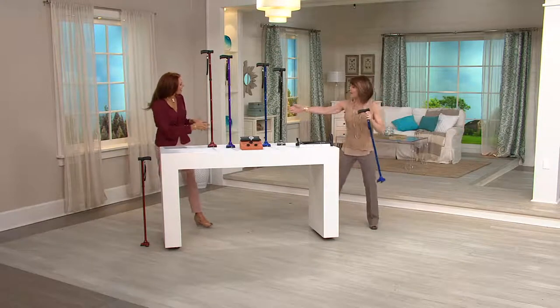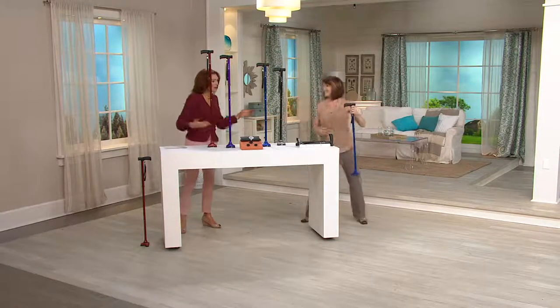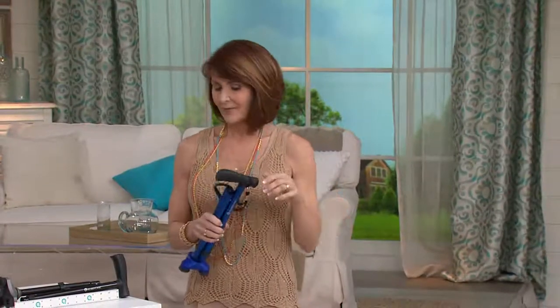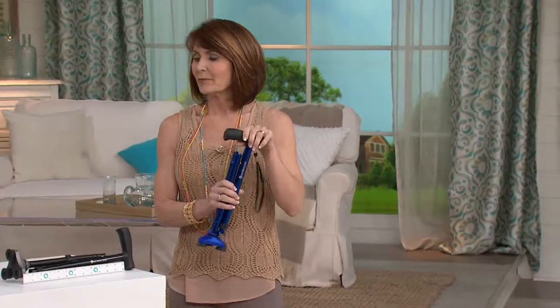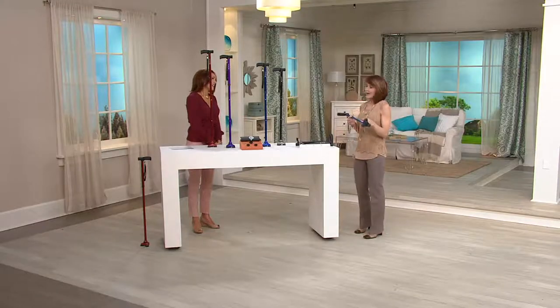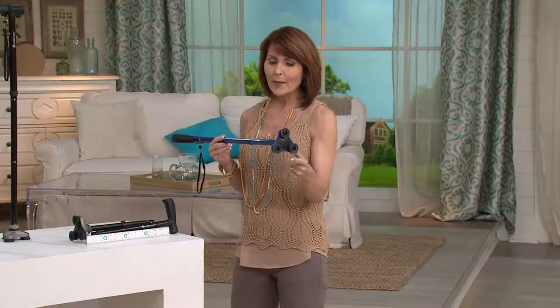Miss Denise Repco, how are you? Good to see you. We have such a long table. Let's talk about mobility and why traditional canes really aren't as effective as we'd like. Traditional canes aren't nearly as effective because they have one point of contact on the base.